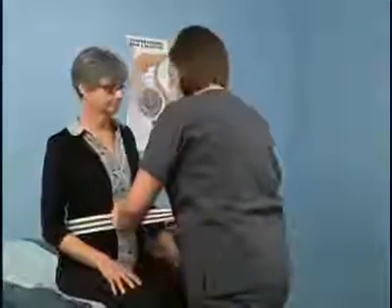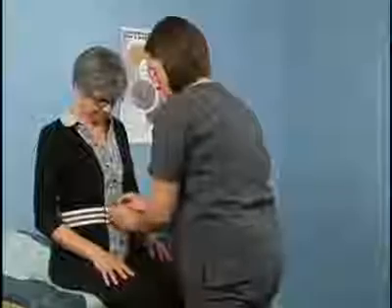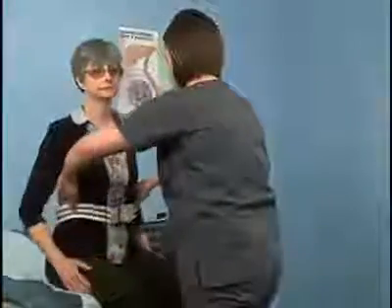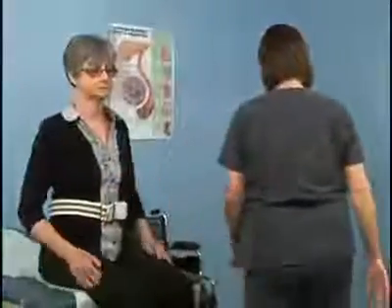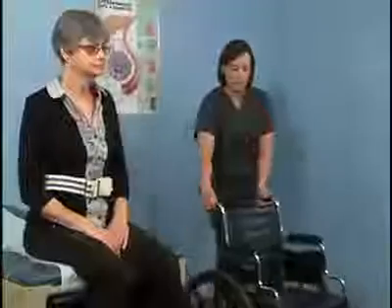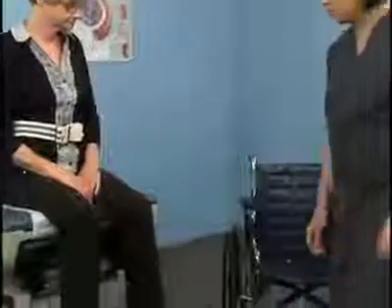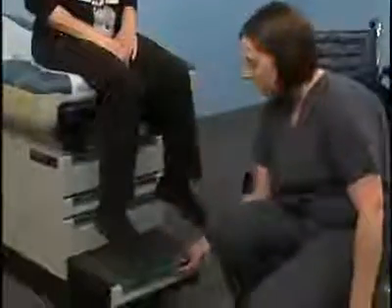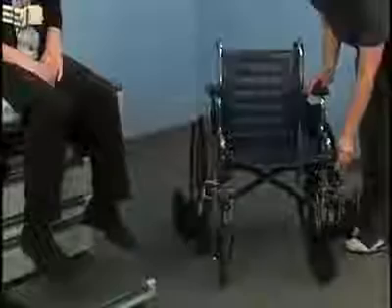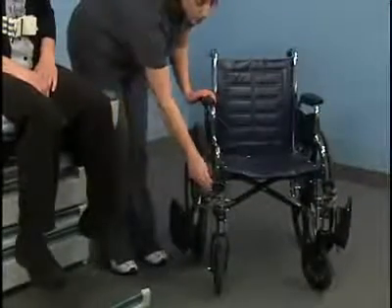When the patient is ready to return to the wheelchair, put the transfer belt back on. Position the wheelchair at a 45-degree angle to the end of the examining table. If the table is height adjustable, adjust it to the same height as the wheelchair or slightly lower. If the table is not height adjustable, such as the one you see here, pull out the table's footrest. Lock the wheelchair and fold back the footrests if needed.